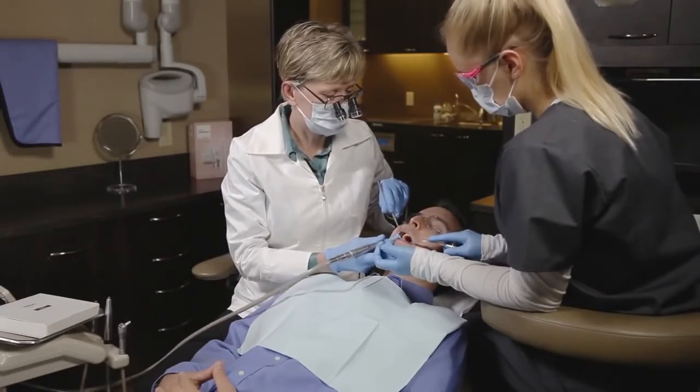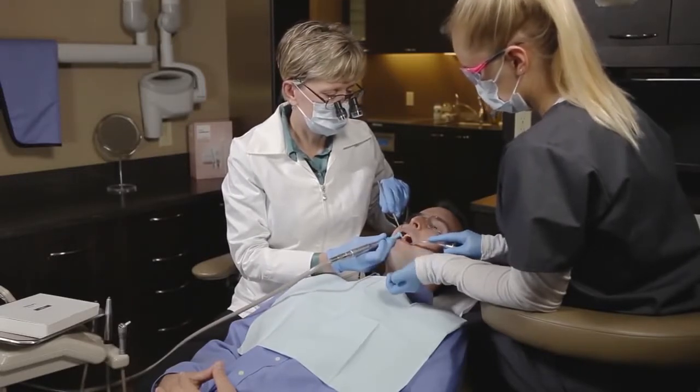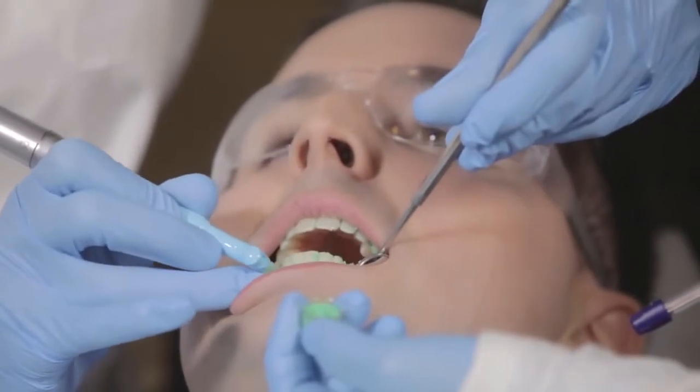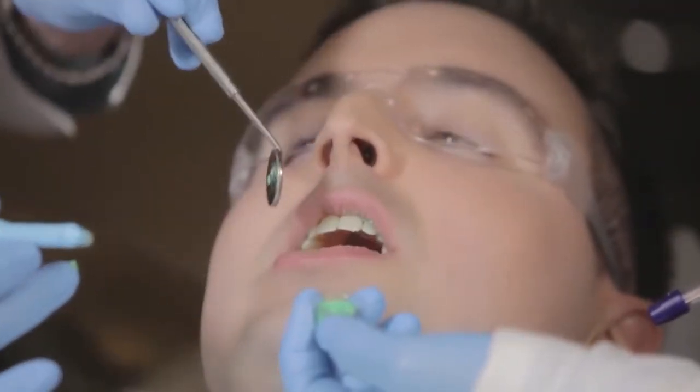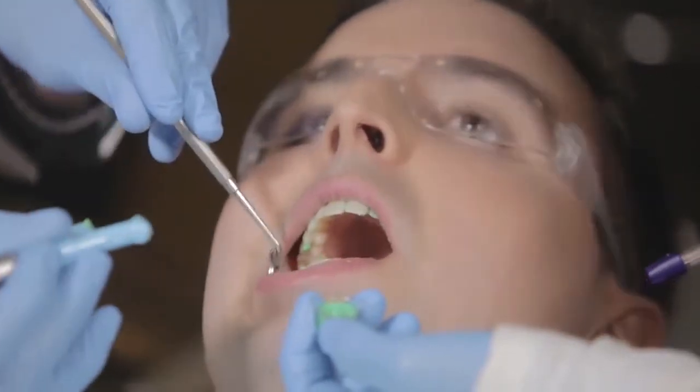This makes it an easy addition to a regularly scheduled Prophy appointment. If you are applying a fluoride varnish, the Quick Pro whitening varnish should be applied first and the fluoride should be applied only to non-treated tooth surfaces.